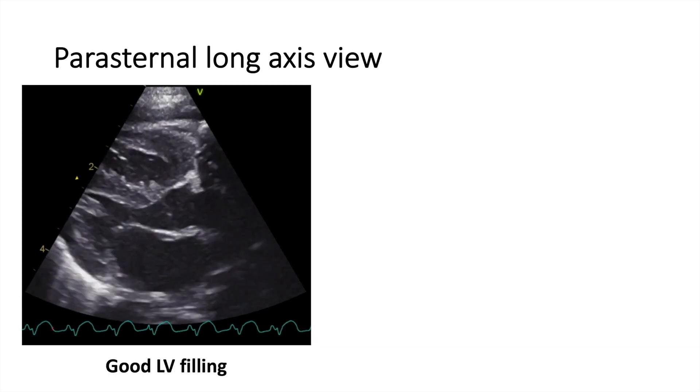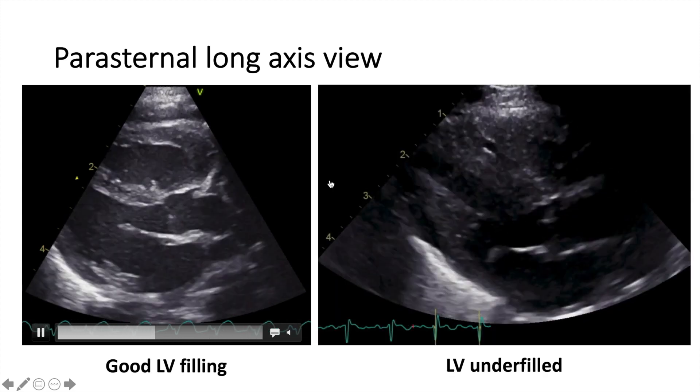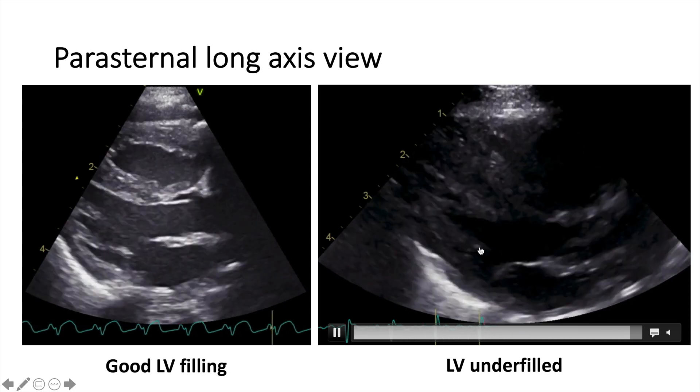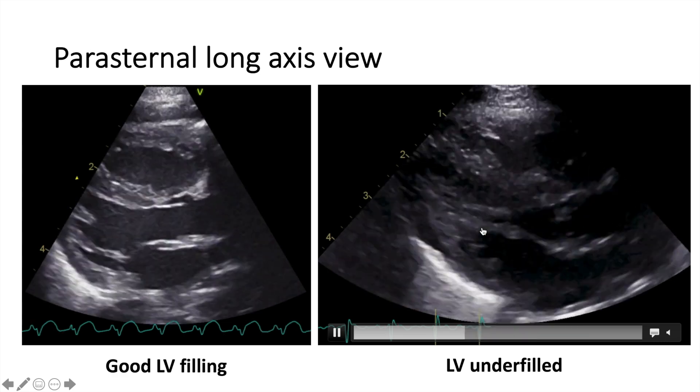We also look at the filling. There is good filling here of the LV versus this example, where the posterior wall and the interventricular septum are almost kissing, suggesting a decreased or underfilled left ventricle.